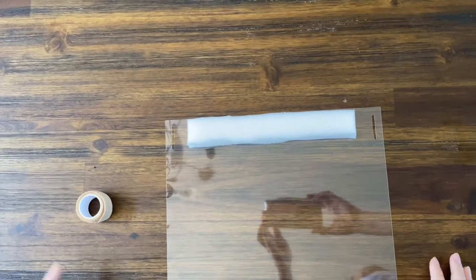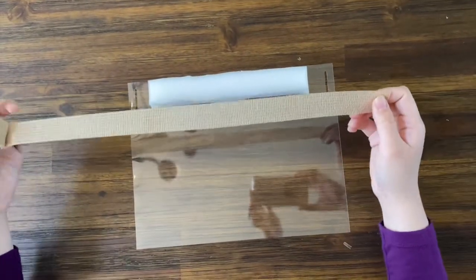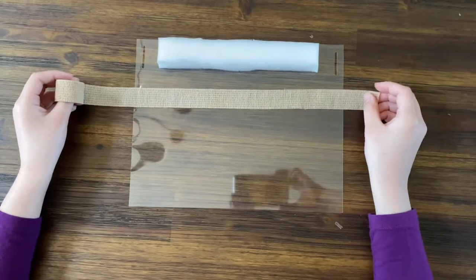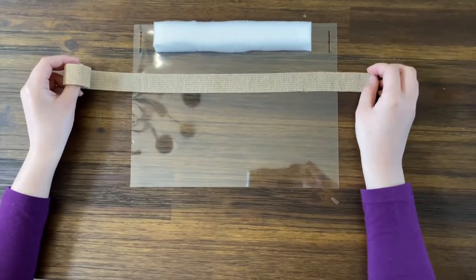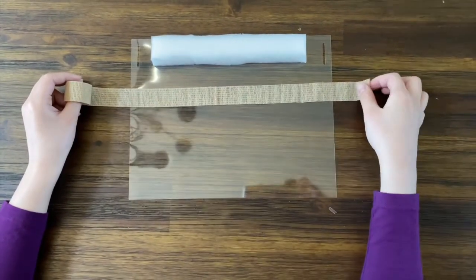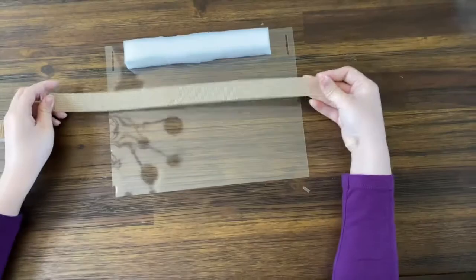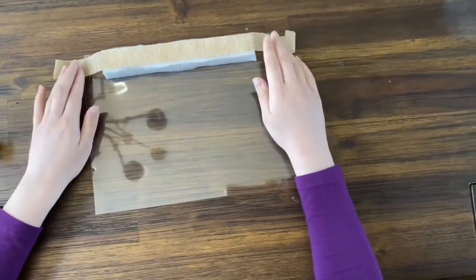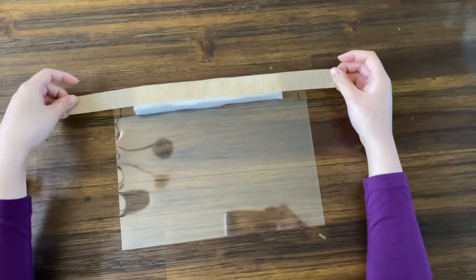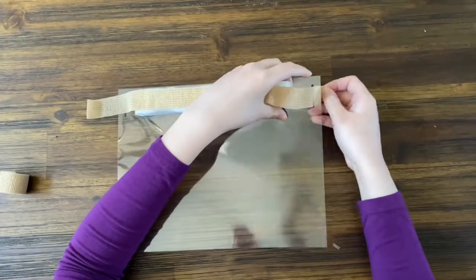So the next thing we're going to do is take the co-band. If you have it, like I said earlier, you don't have to do this step if you don't have it. So you measure it out before cutting it. What I usually do is I set it down on the flat part, and then I measure off about this much on either side to make sure that it will be able to easily wrap around when I put it through the holes. Okay, so once you cut it, what you're going to do is place it kind of near there, and then make sure on both sides that they're kind of equal. And then you're going to put it through the hole you made with the hole puncher.